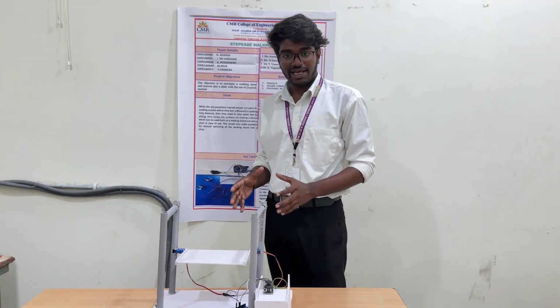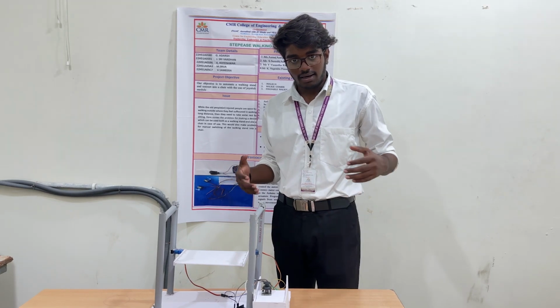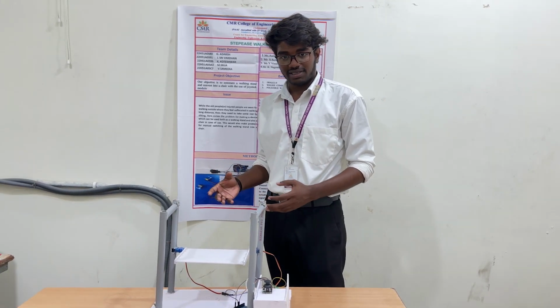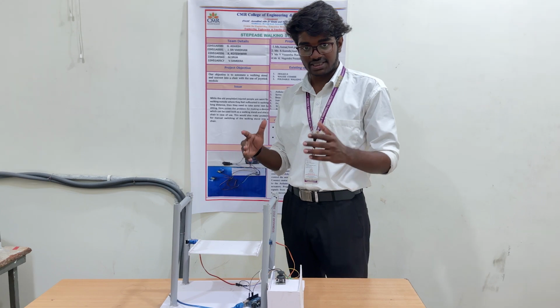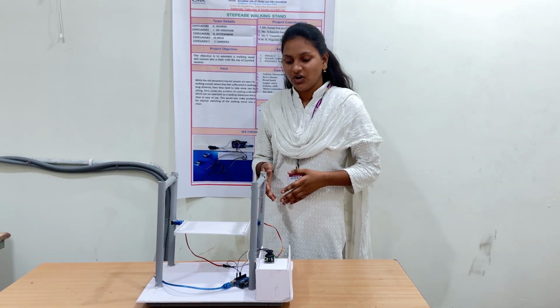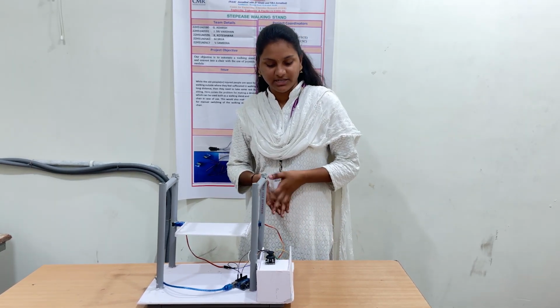So our main aim is to combine both. Elder people and handicapped people will use walking stands, right? But if we combine this crutch device with it, then there is a chance to take rest. So we have used components like Arduino, joystick, foam sheet, servo motors, jumper wires and breadboard.